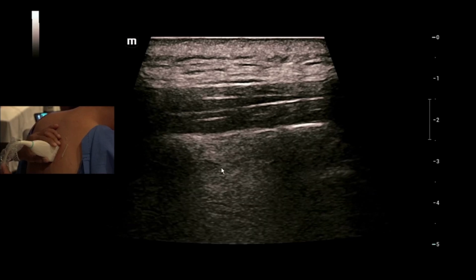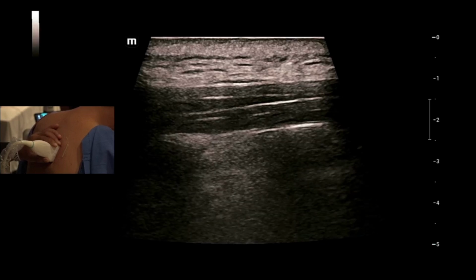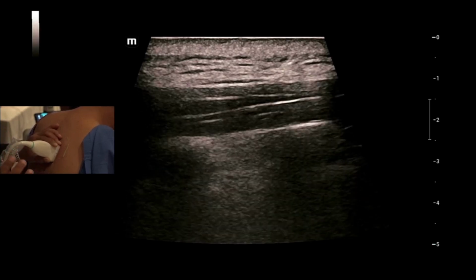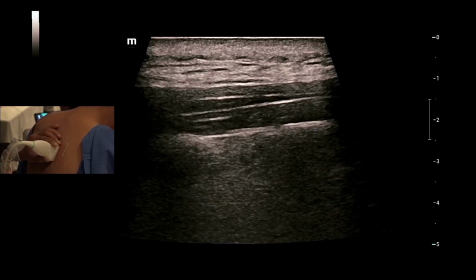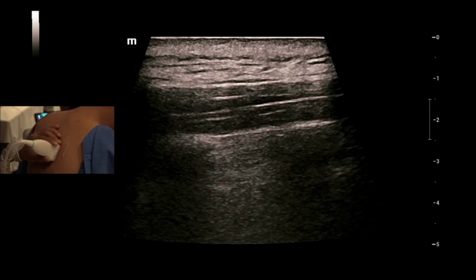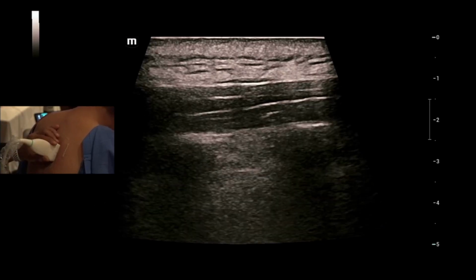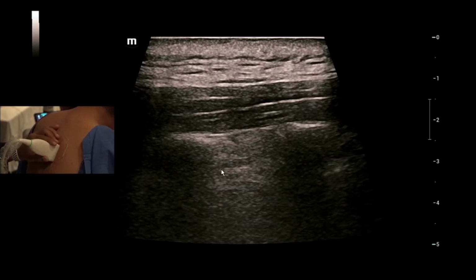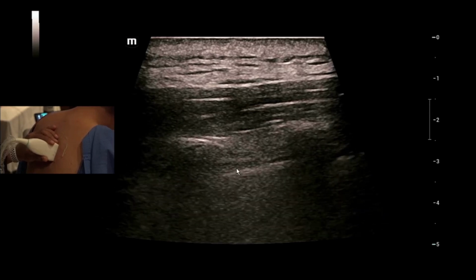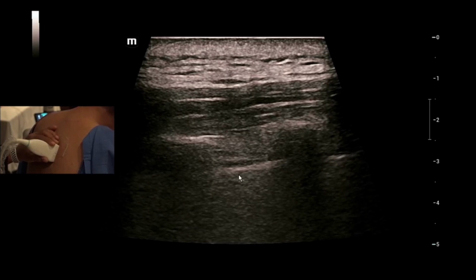Now you must be saying, hello, the pleura is so fuzzy, how do I know I punctured it or not? So one reason why I don't do the injection here, this is traditionally where we do the landmark-based paravertebral injections. So your pleura will be very fuzzy. But there's a little secret that will make it clearer, is if you just tilt the probe slightly outward, see? Can you see that? Oh, now it can be seen.